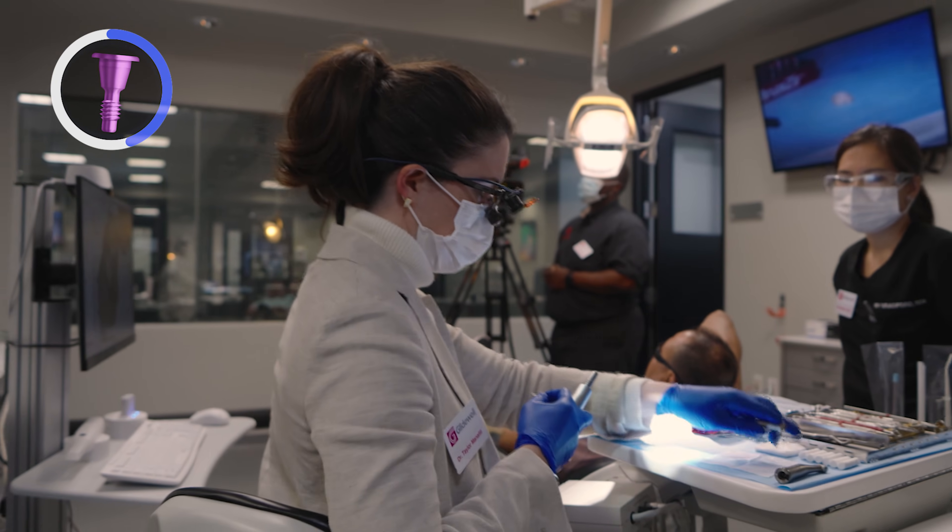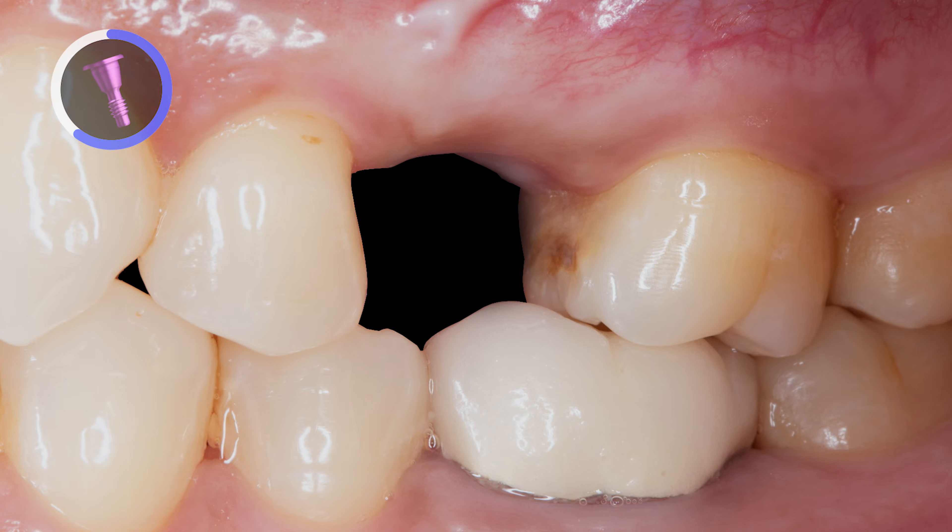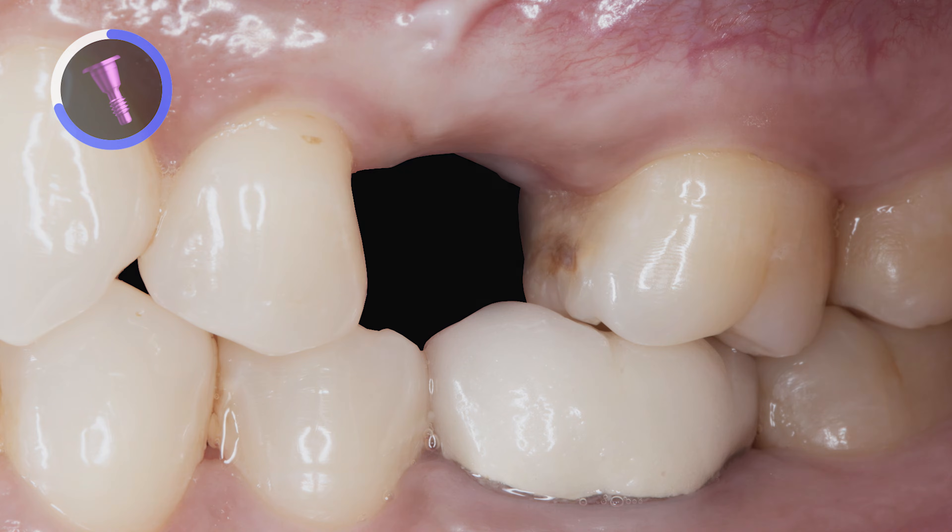At this visit, we will be uncovering the now integrated implant using a laser and taking a definitive impression at the same visit, utilizing an intraoral scanner.